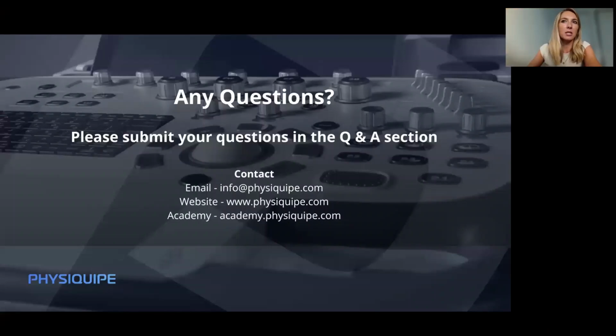And then anterior impingement problems with ultrasound, is this something that you have experience with? Yeah. So I presume anterior ankle impingement. Yeah, absolutely. Why ultrasound is really helpful here is that you can dynamically assess the ankle, so you can try and recreate the pain to see what is actually causing that impingement, be it a thickened ligament, or fluid in the anterior joint, either anteromedial or anterolateral, whether there's fluid in that joint space. So it can be really helpful in assessing it and seeing if that is a true cause of their pain if you're clinically diagnosing them with anterior ankle impingement.